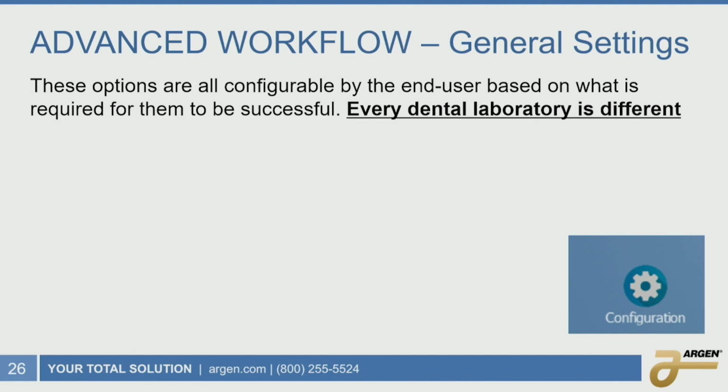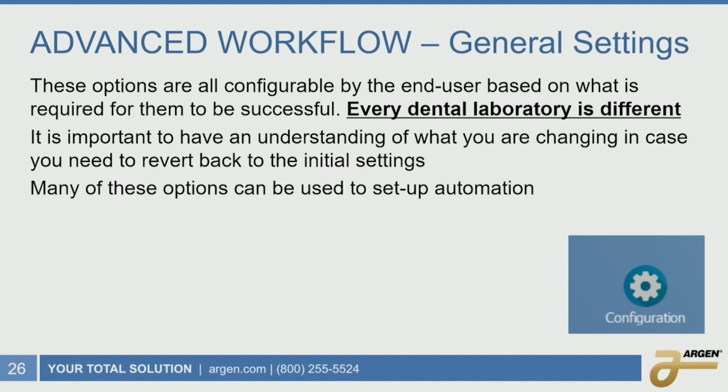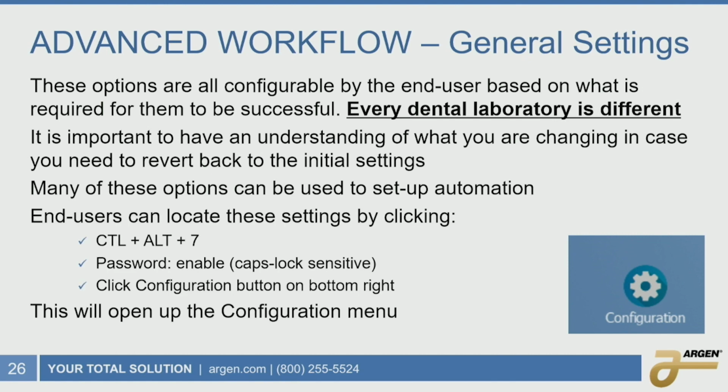So the simple workflow is fast and easy, but there are also ways to even optimize that with some advanced features here. And we're going to get into the configuration button here. To get there, we need to get into one of the admin areas so that we can customize it to fit our workflows. You also need to know that what you change can affect how your software interacts with you. A lot of these can be set up so you can still use the simple workflow, but it will make your customized settings work.